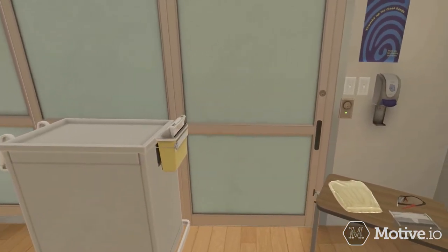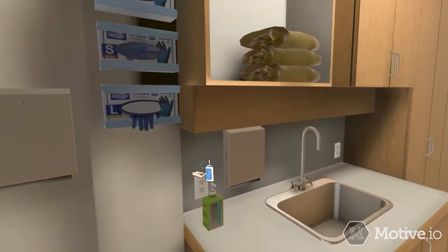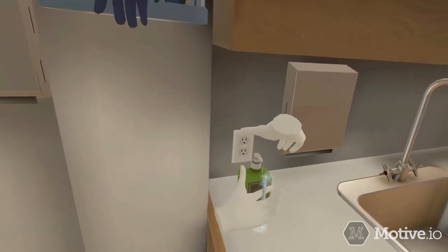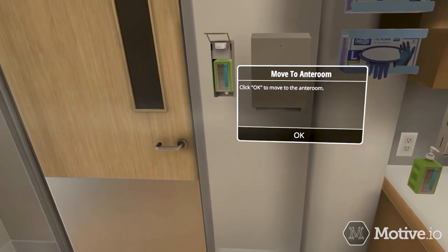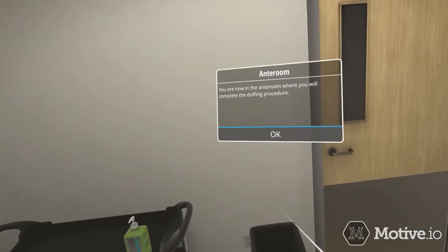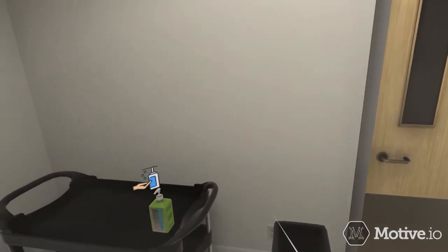Perform hand hygiene using an alcohol-based sanitizer. Clean all surfaces of hands and wrists for at least 20 seconds. Allow your hands to dry before moving to the next step. Move to the anteroom or a hallway to doff the remainder of your PPE at a safe distance from the patient. Perform hand hygiene using sanitizer.